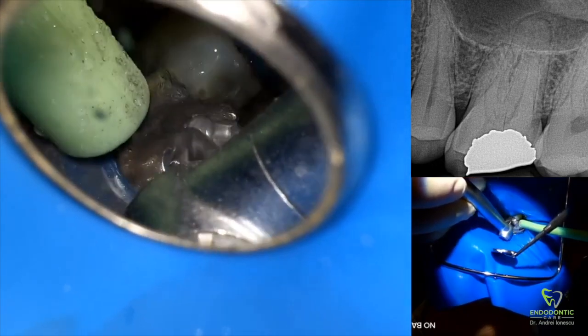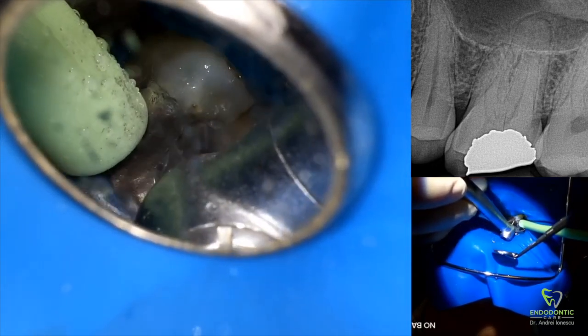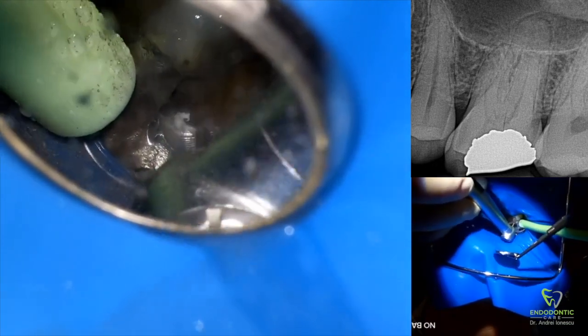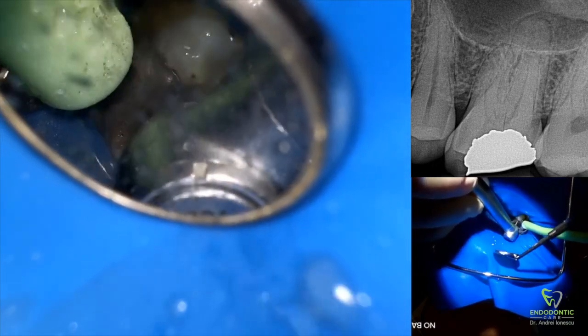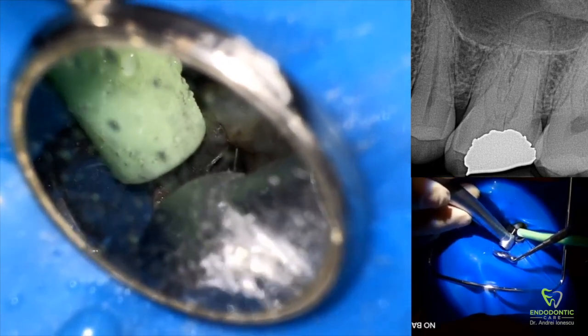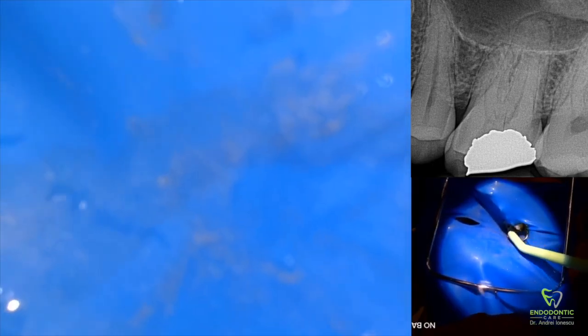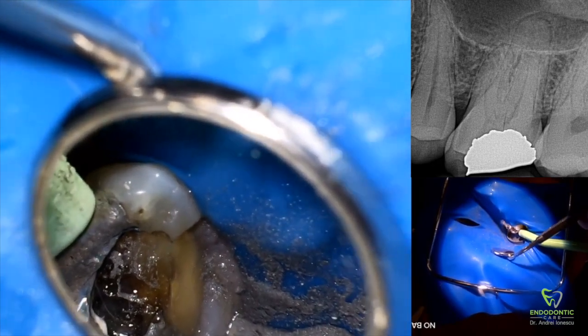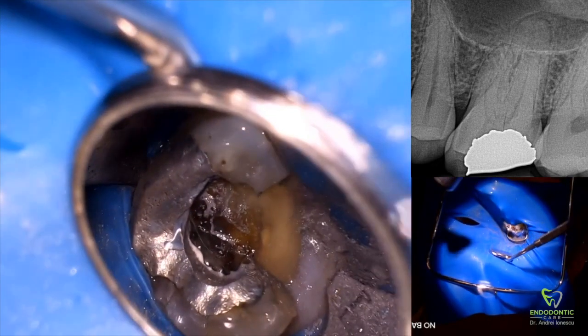The first step is to make your access preparation. Right now I'm removing as much amalgam as necessary — I want to cut back a lot of the amalgam so that I can allow light to come in and see what's happening, and then remove as little pericervical dentin as possible. Once I start making my access into the tooth, I don't want to have to touch the amalgam again. I don't want little flecks and bits of amalgam falling into the pulp chamber and into the canals.